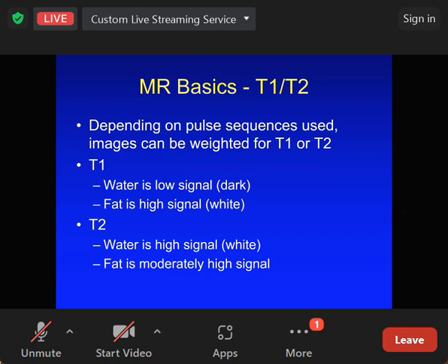out a radio signal in the same way that if you remember doing fluorescence in chemistry, you excite electrons from one energy shell to another. Then when the exciting energy is switched off, the electrons fall back, emit energy, and in that case, it's fluorescent light. In this case, these are protons, not electrons, and we're getting radio waves back. Depending on how we give the pulses, it depends on what sequence we get back.